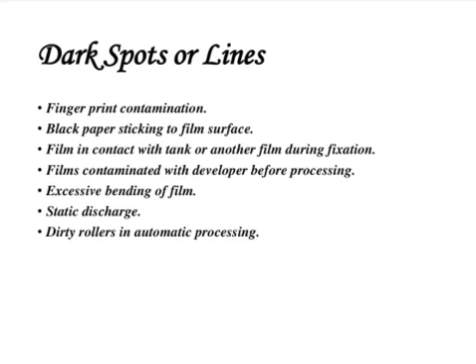This occurs when the floor of the mouth or the palate is more shallow and the entire film or image receptor cannot be accommodated in the floor or in the palate. In such a case, there can be excessive bending of the film if you're using film-based imaging, and that will leave a black line.